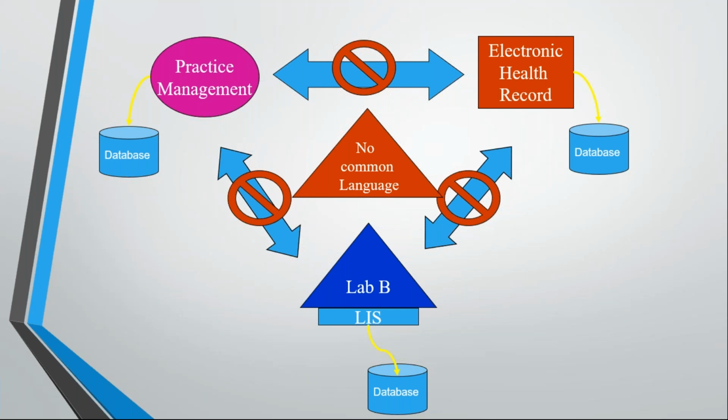In a very similar way, practice management is just a software, and it is just showing the data which is present in the PM database. The same applies to electronic health record. They have their own EHR database where the entire data is stored. EHR is just acting as a mirror, a reflecting software which is reflecting the data from the database. The same logic applies for any software application, not just these three. Any software application will have that architecture.